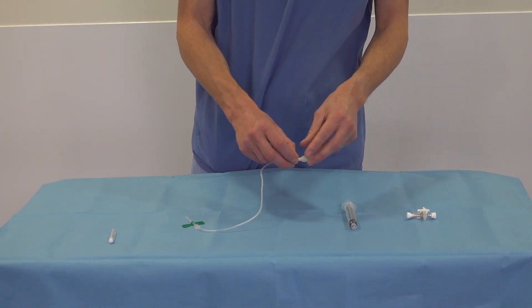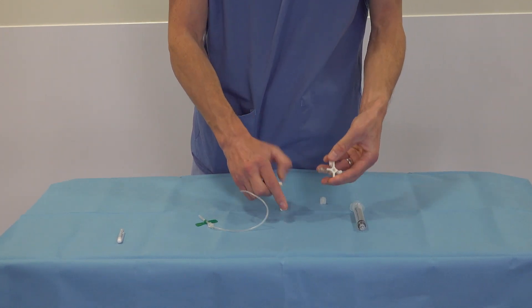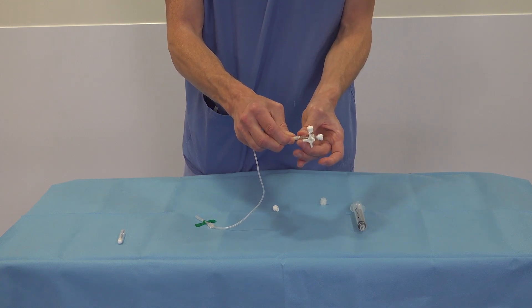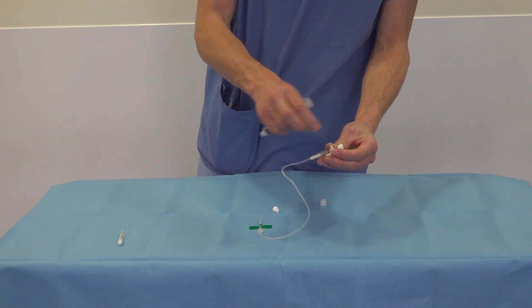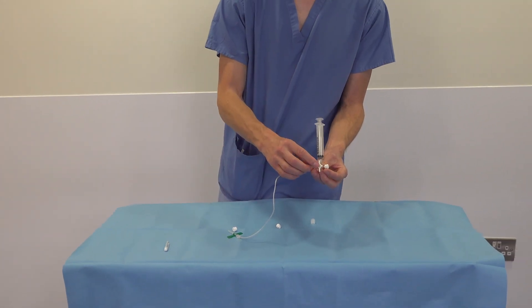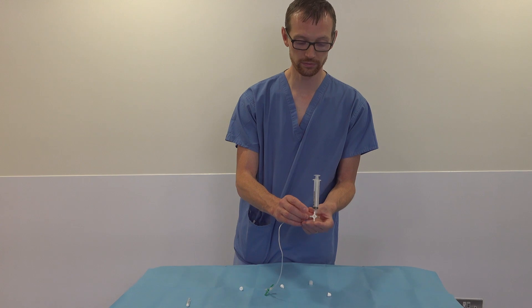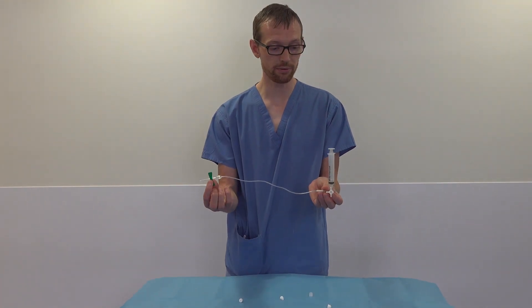Take your butterfly and connect it to the 3-way tap and just secure it. Take the 10ml syringe attached to the top and make sure that it's closed off to the atmosphere. Now we're ready to decompress the pneumothorax.